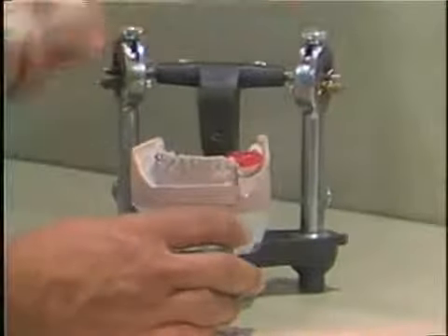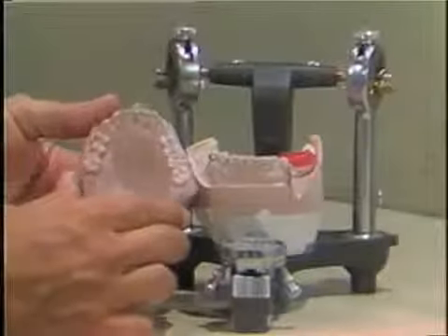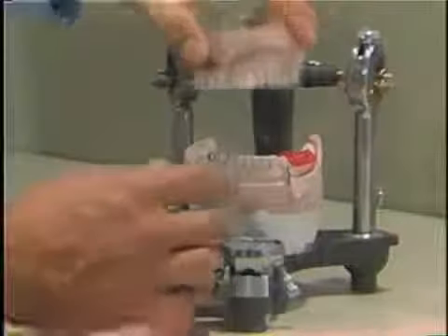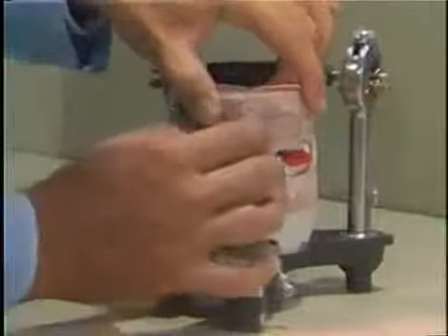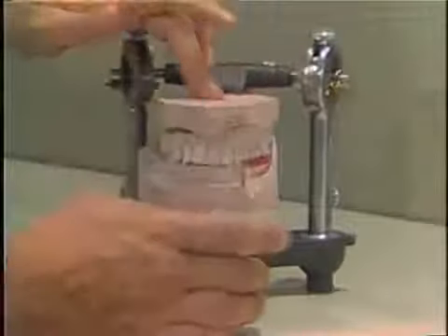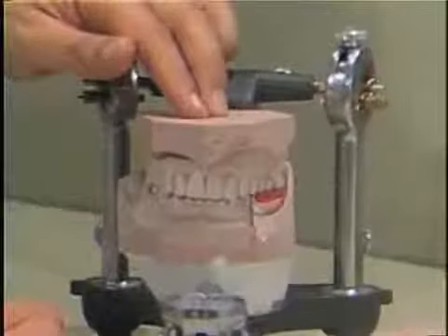We can then take an opposing model, a cast of the opposing dentition, and place it into that centric relation, centric occlusion recording, placing the remaining dentition in the centric occlusion position.